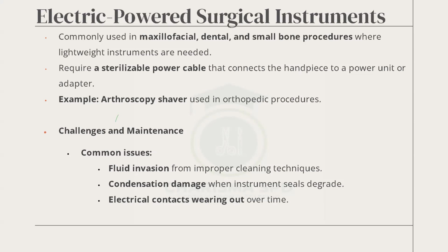Some part of ENT, the ear, nose, and throat section of your body. Dental, the mouth. Then small bone procedures. The bones are in your skeletal system, so that comes to maybe orthopedic work. All right, where lightweight instruments are needed.